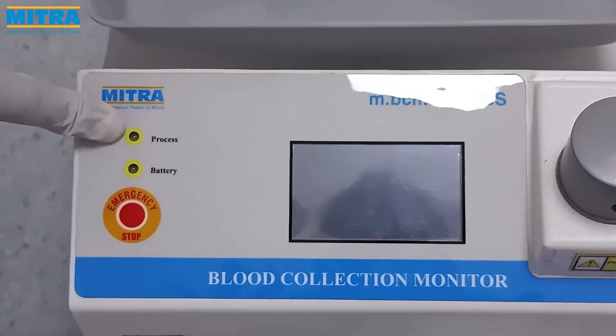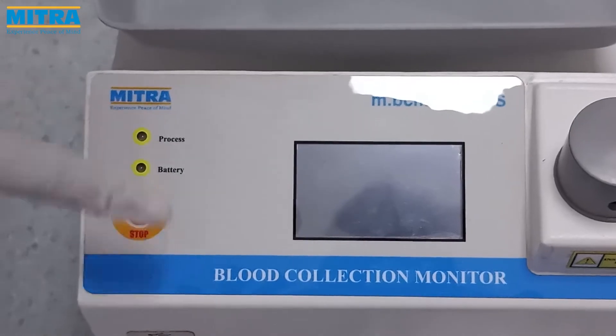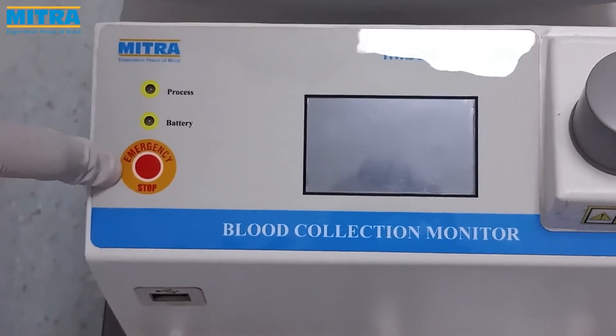This is the process indicator which is red when balancing is in process. This is the emergency stop button to terminate the process.